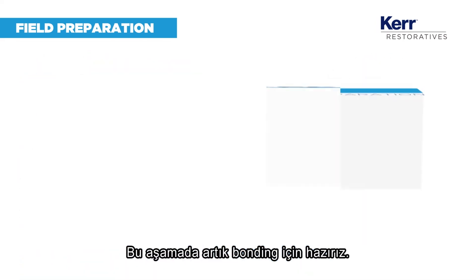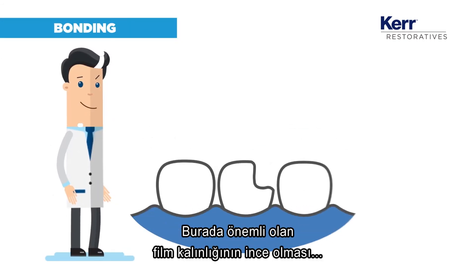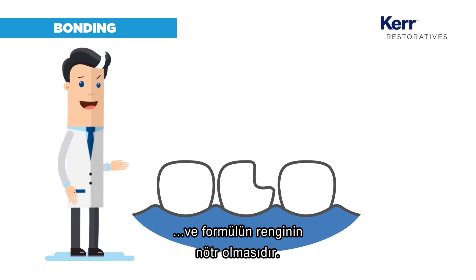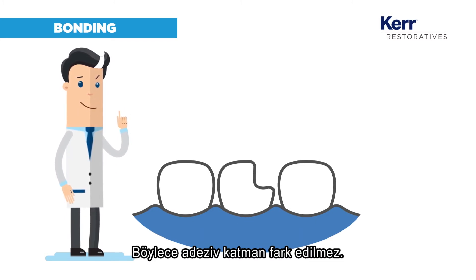At this stage we are ready for bonding. The key is to ensure film thickness is low and the color of its formula is neutral, so that the adhesive layer is imperceptible.